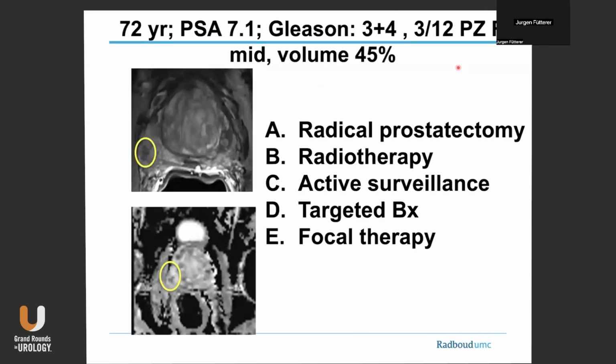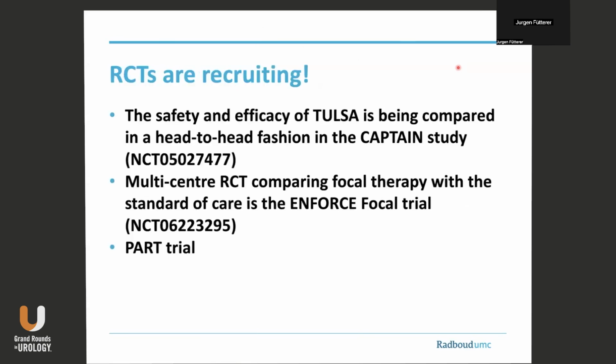Coming back to my patient and one of my last slides, this is still a lesion visible on the right side. And my question to you is, and I hopefully could convince you that this could be a patient for focal therapy. RCTs again, they are recruiting. Several RCTs are underway. They are recruiting patients, and I'm looking forward to the preliminary results of those studies because we need evidence.